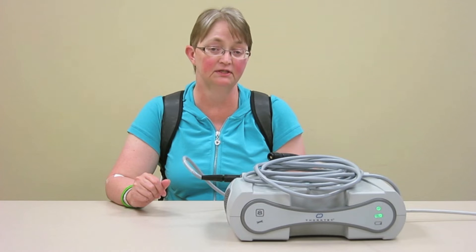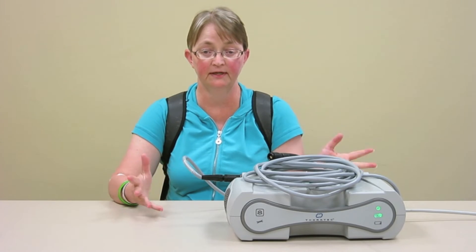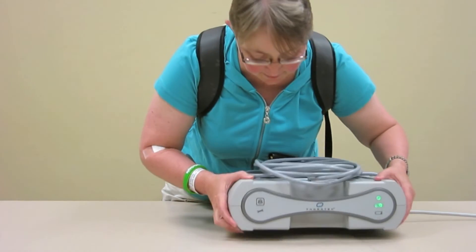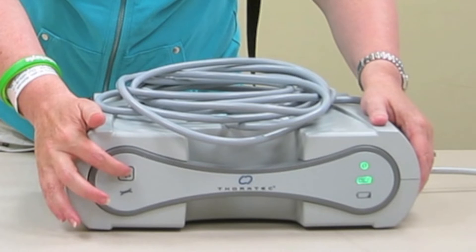You also need to do a daily self-test with your power module as well as your controller. I usually do both of mine in the morning when I get up, and then it's done for the day and I don't forget. You just hold the button down for five seconds and it will start the self-test on its own.